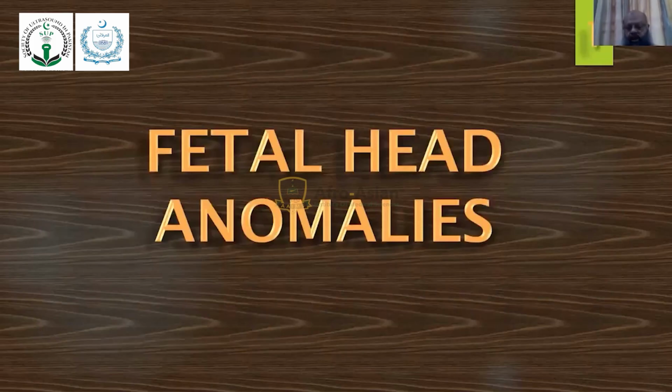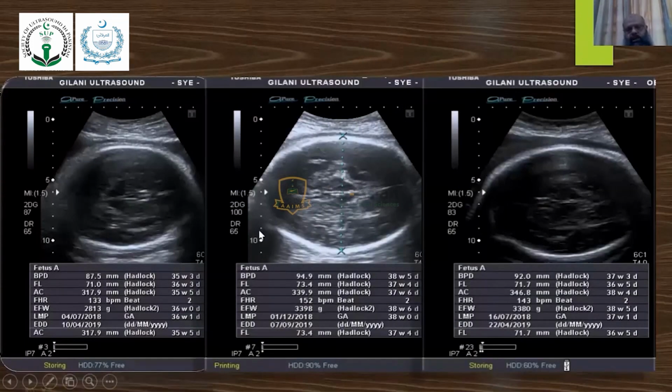Fetal head anomalies. This is how we take the fetal head measurements. This is for BPD. I hope most of you know that this is the falx cerebri, the thalami, the cavum septum pellucidum, and the parietal bones. So biparietal means between the two parietal bones.